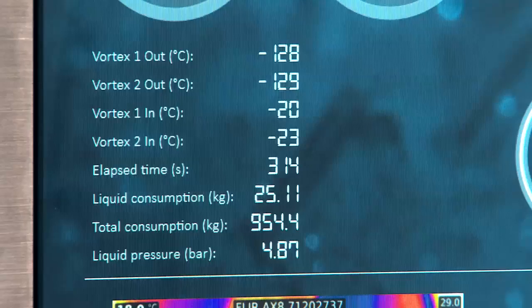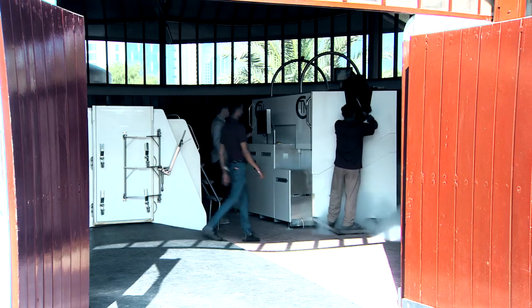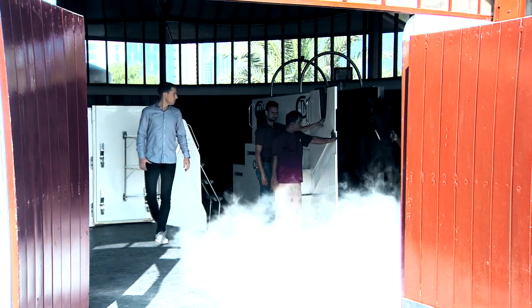What makes it cold? A simple application, liquid nitrogen at a very, very low temperature, mixing with air and pushing it inside the cabin where the horse stands. The future of racehorse recovery? Only time will tell. But at the moment, at least Zabeel can boast a world first.